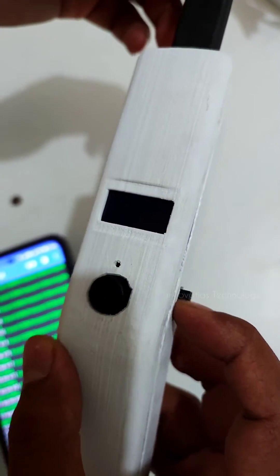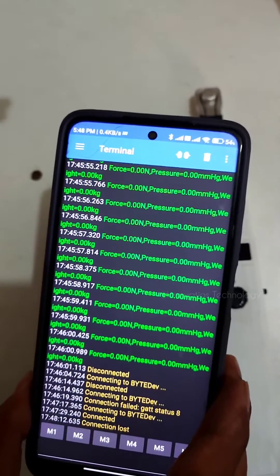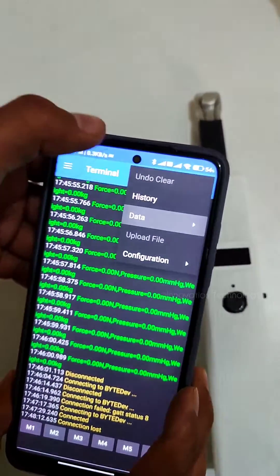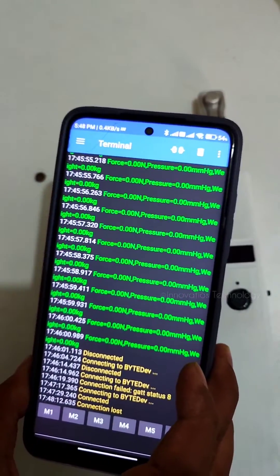Whenever you are sending the device anywhere, just power it off. The application also has different features — you can export data and share it in different formats.